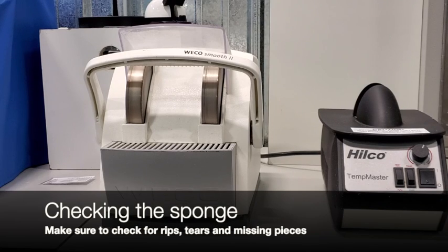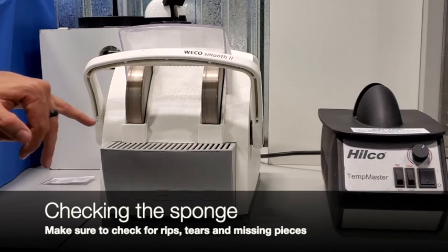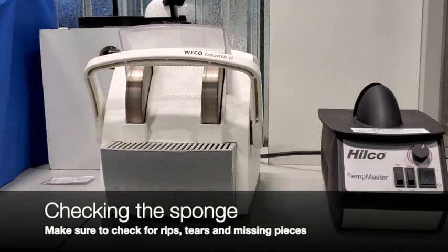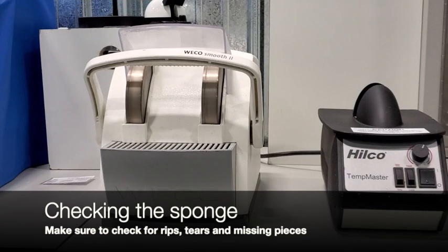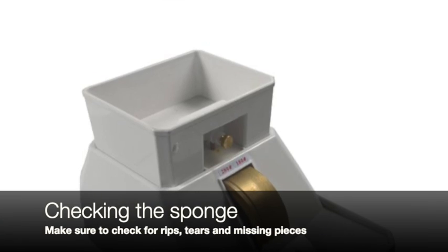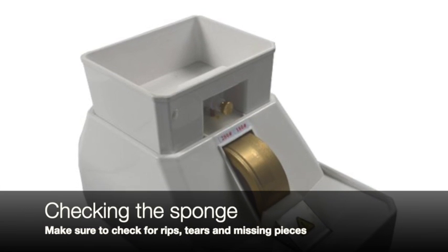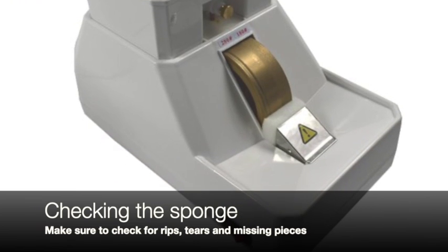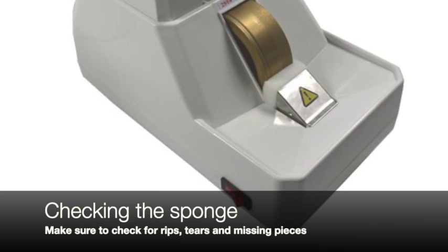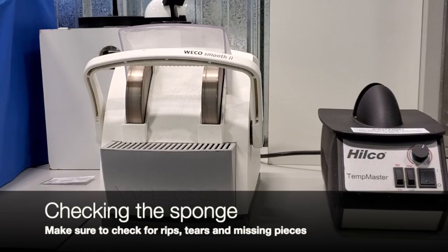On our unit that we have here, the sponge is actually down here in the grates. So again, we're looking for any chunks missing, or the sponge missing altogether. In our sustainable labs, most of yours have a water tank here on the top, and then there's a sponge right below it. You can actually see it here in the picture. So that's what your unit would look like. Again, our unit's a little bit different, but the main things you're looking for are pieces missing out of the sponge, or the sponge just being missing altogether.